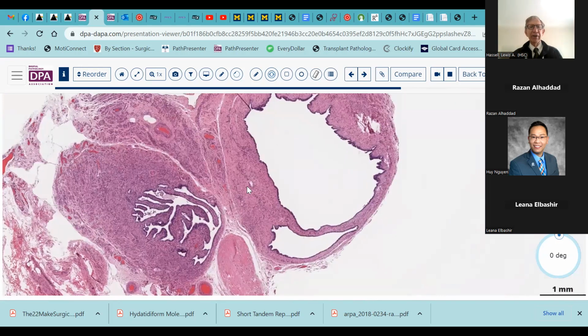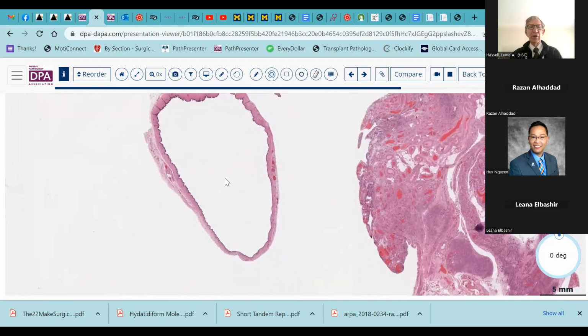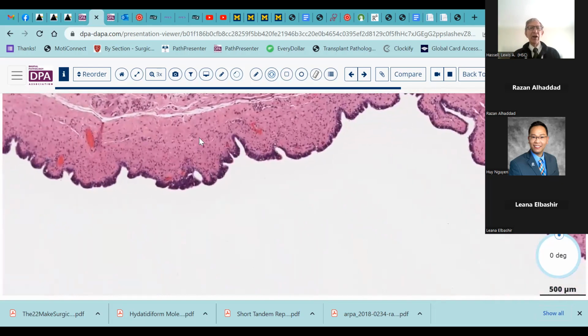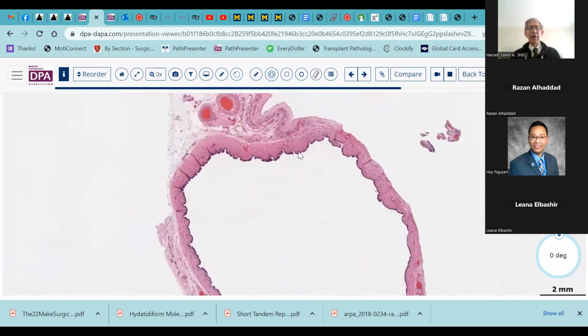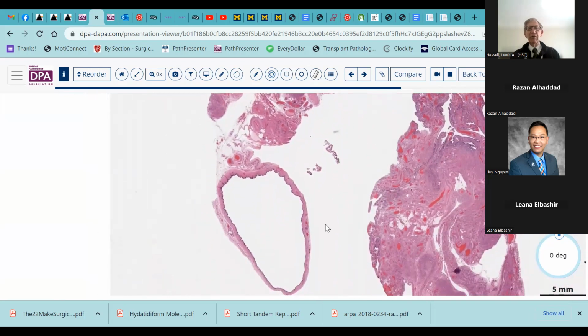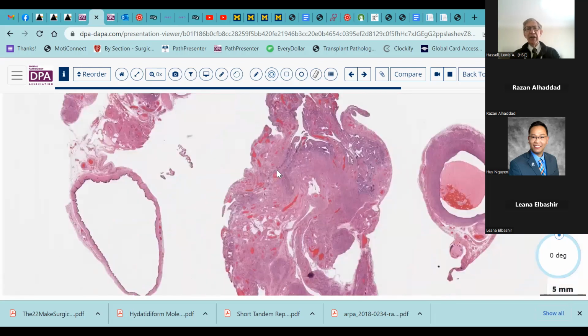But we also have, living in the same area, the remnants of the Wolffian duct. And so this mesonephric-defined rather than Mullerian-derived lesion or structure can also have a little bit of smooth muscle in the wall and have a columnar epithelium, occasionally with cilia, that has made us generally not worry about whether something is Mullerian or Wolffian in terms of derivation. So this could be all fallopian tube with areas that are dilated and areas that are not. Or it could be that we have fallopian tube here, and we have areas of Wolffian duct that are dilated and forming a small adnexal cyst.